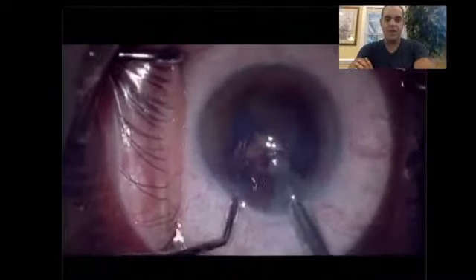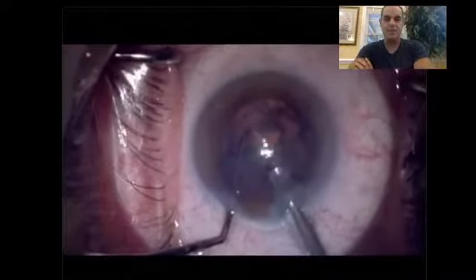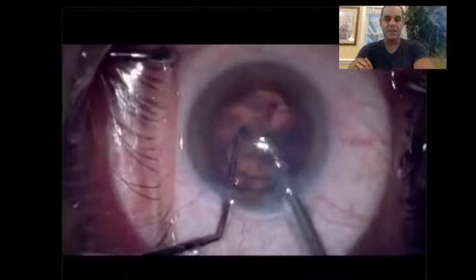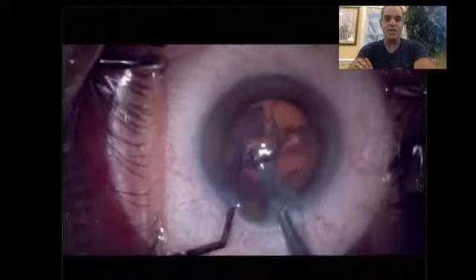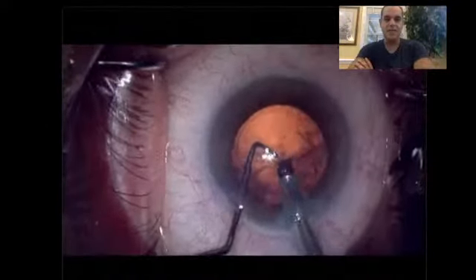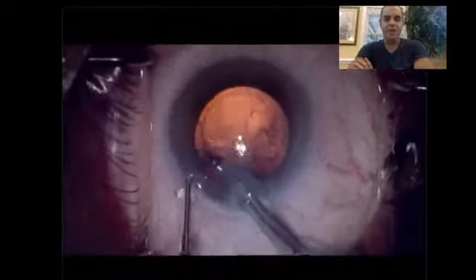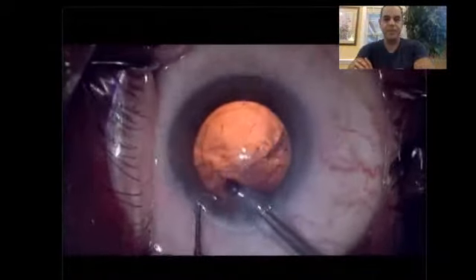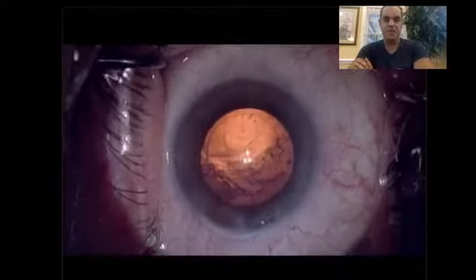And then for when I come to remove the last pieces here, I want to protect the posterior capsule. This is a blunt tip chopper, but I still like to rotate it sideways. So if the capsule does come up, it's against the back part of the chopper. Right there, all I'm doing is checking for pieces at the paracentesis.